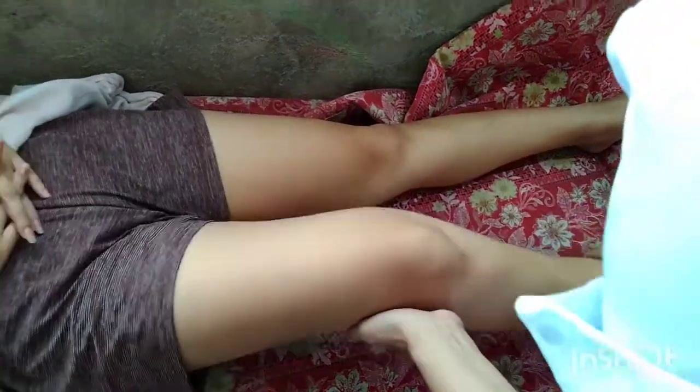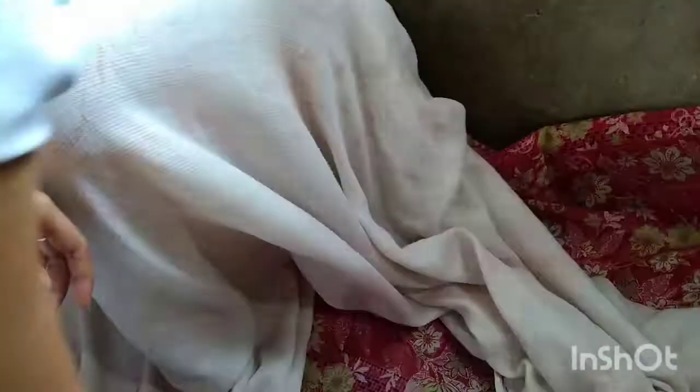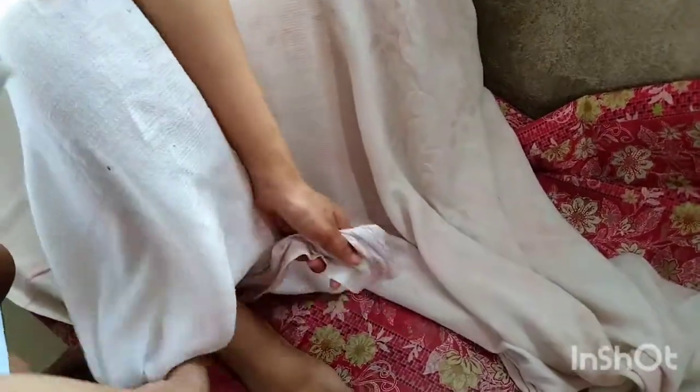Next is place patient in dorsal recumbent position if female and bring knees up and out, and may need assistance to keep knees in the position if male. This position provides for good visualization of the urinary meatus and perineal structure. Next, let's proceed in draping the patient with top sheet, to expose perineum and avoid unnecessary exposure of body parts and maintain client's comfort.